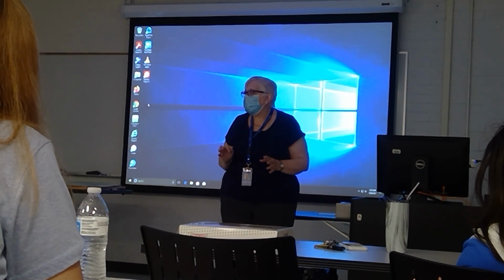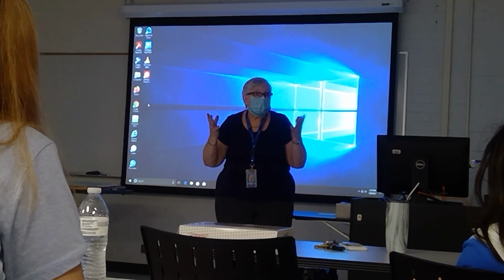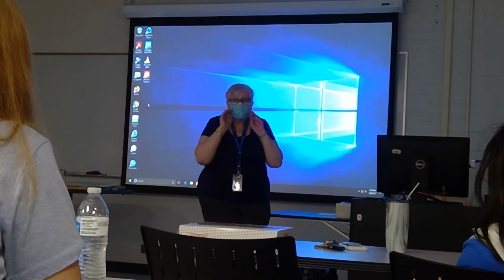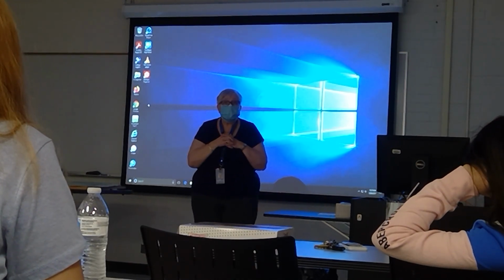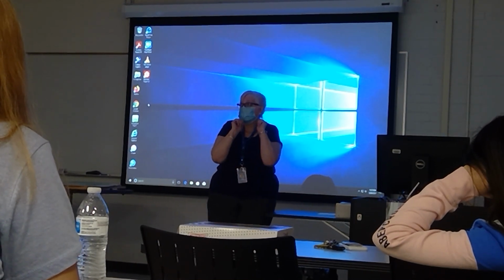Then what? You go out of the room, you shut the door, you switch on the machine. What happens? You're looking at the MLC and you're looking at the patient.